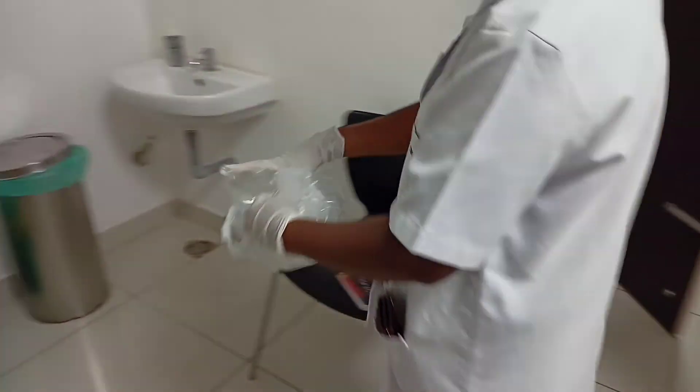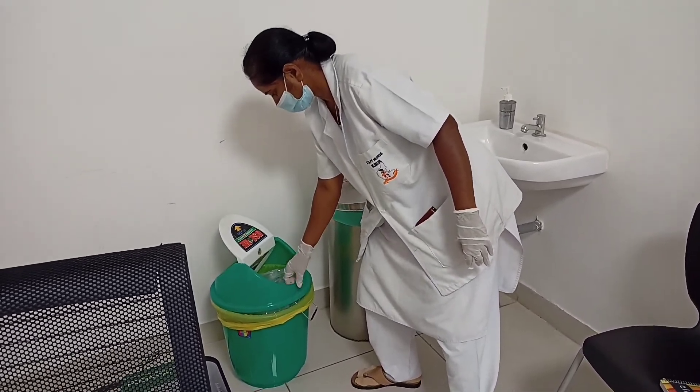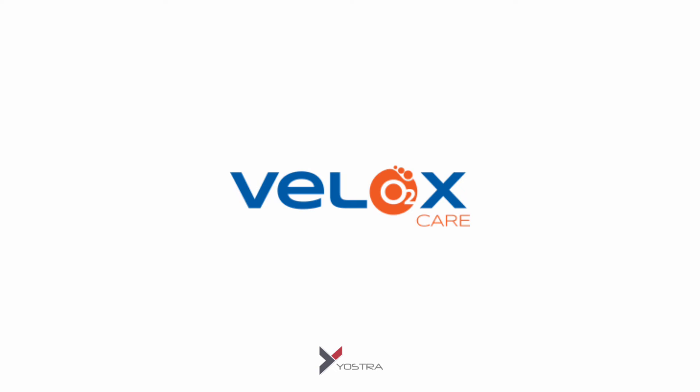Put the used therapy bag into the instructed waste disposal containers.